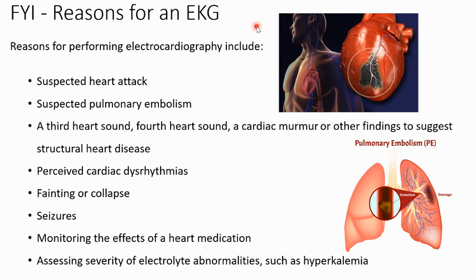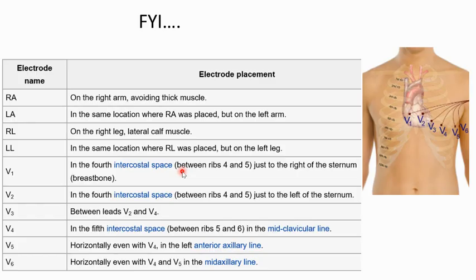And again, you can take a look at this if you want. Why would a doctor ask for an EKG to be conducted? Again, suspicion of a heart attack, a pulmonary embolism, third or fourth heart sounds, murmurs, structural disease, these kinds of things. This is why they might ask for one. I'm not going to ask you on the test. Again, this is something you're going to learn in the nursing program if that isn't in fact what you're doing.